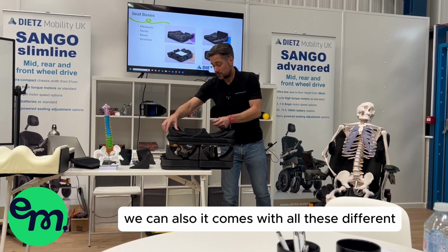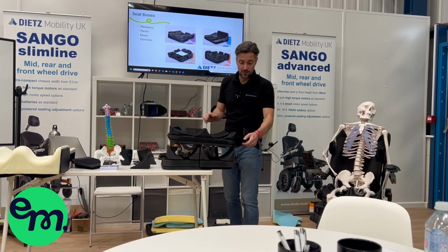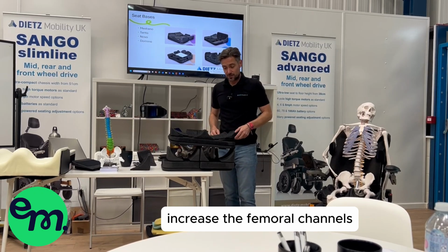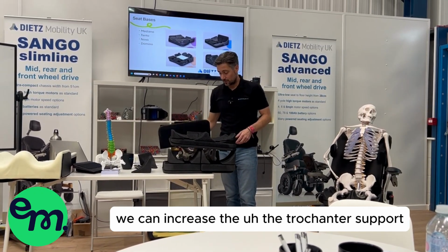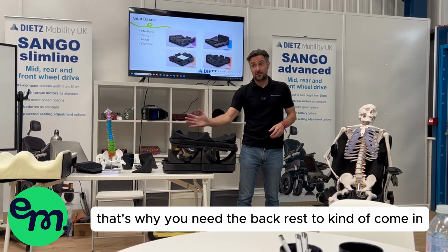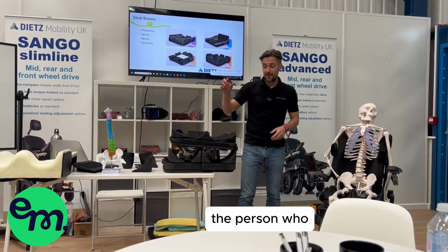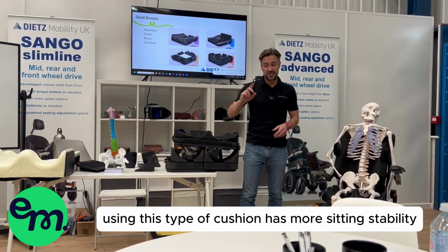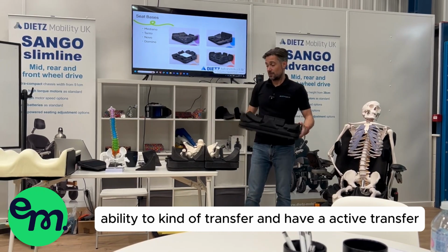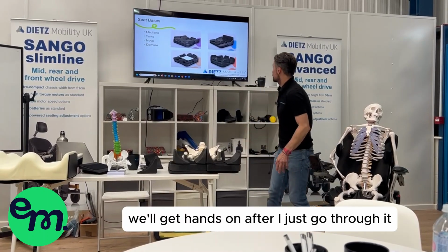It comes with all these different additional parts as well, so we can build up the front, increase the femoral channels, we can increase the trochanter support. You do have smaller posterior prompts here, but that's where you need the backrest to come in and fill some of that in. But you do have a little ischial ramp. So again, the person who's using this type of cushion has more sitting stability. They have more ability to transfer and have that active transfer. We'll get hands on after I just go through it.